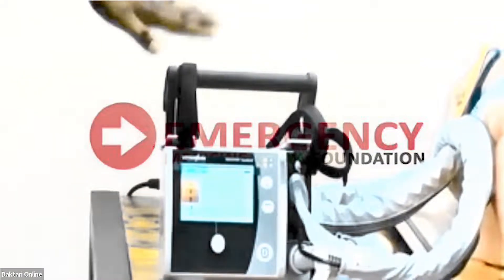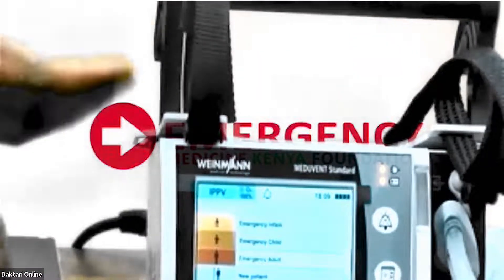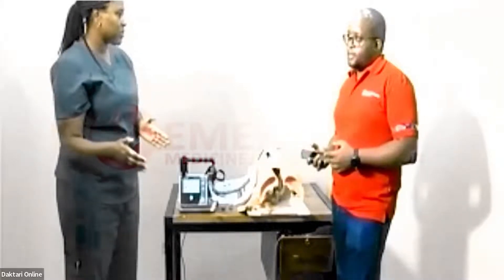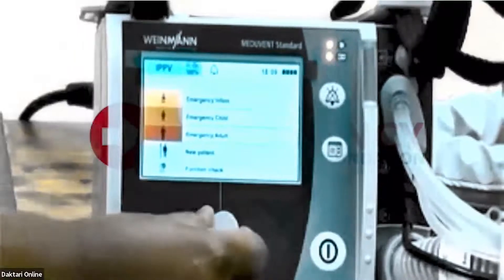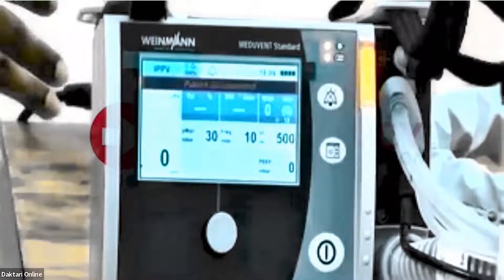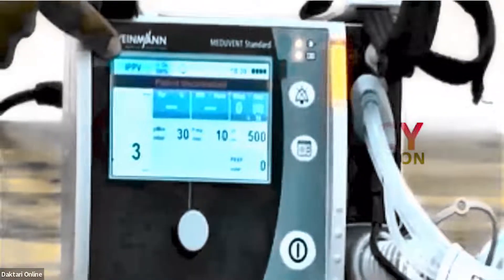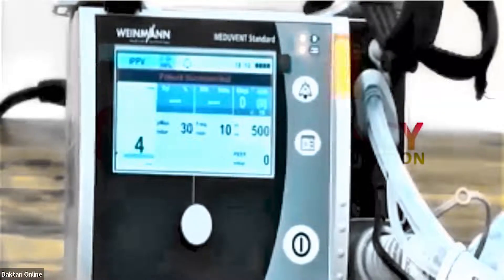The first thing you see is the interface which helps you decide what patient you're going to be ventilating. It has emergency settings for an infant, a child, and an adult. We don't use the same settings for everyone — there are different settings based on height and weight. We tend to use different modes of ventilation for pediatric patients compared to adult patients. Select emergency adult mode using the center button — it automatically goes to invasive ventilator mode.